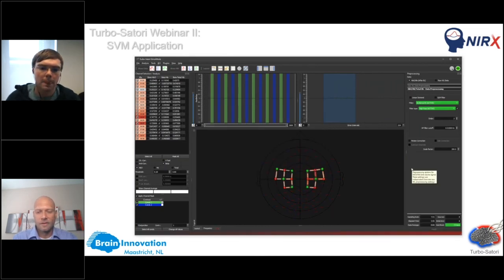Okay, great. Is the GLM implemented as incremental updates of the least squares equation, or something fancier like the Kalman estimator? No, so the GLM is implemented as a real-time way. So the betas that you see are based on the real-time calculations, and then we run a full GLM for the t-test.